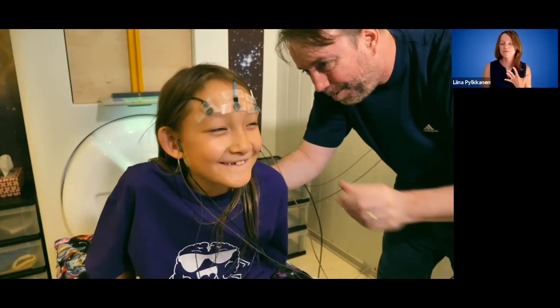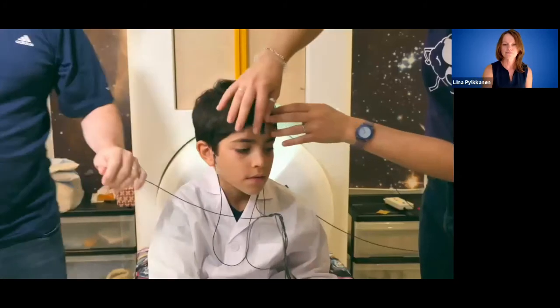at the beginning of the experimental session. So you send a signal to these points. We're able to localize that signal very easily, and that information is connected to our model of your head. And that allows us to figure out exactly where you are. So that's what all these coils are. They're not actually making a brain measurement. They're allowing us to figure out where you are with respect to our sensors.